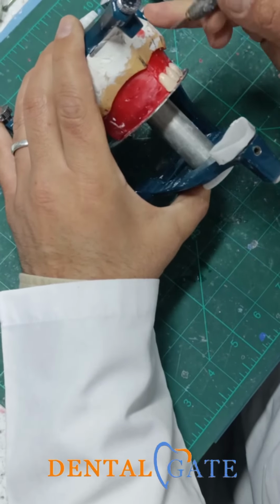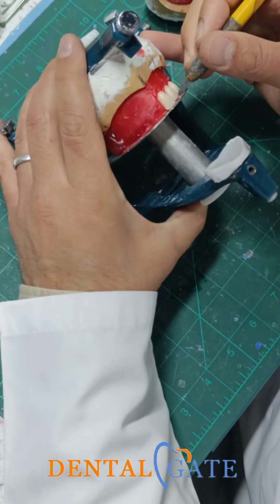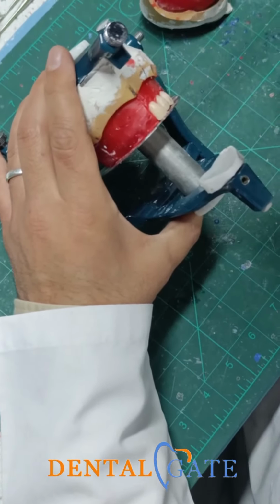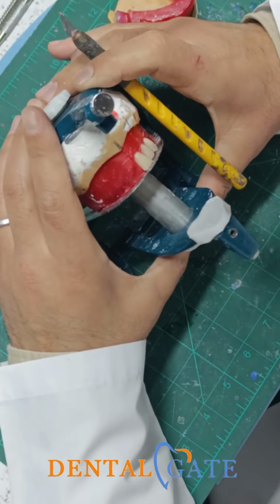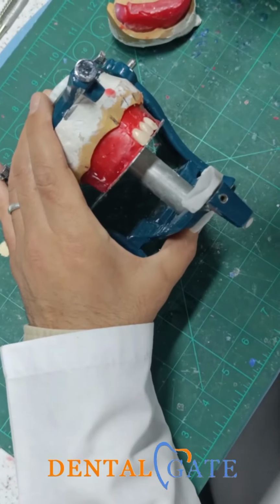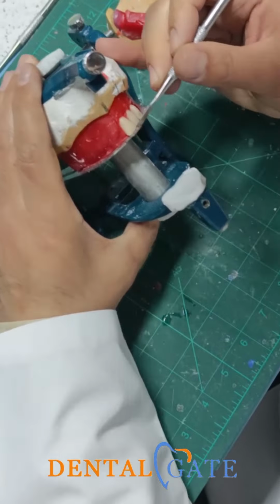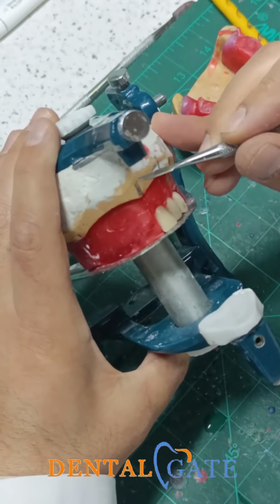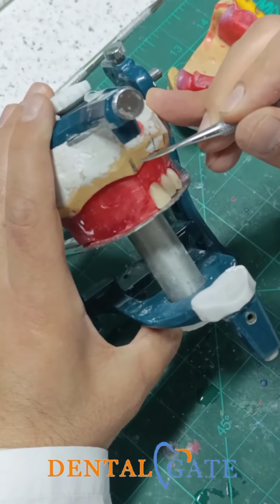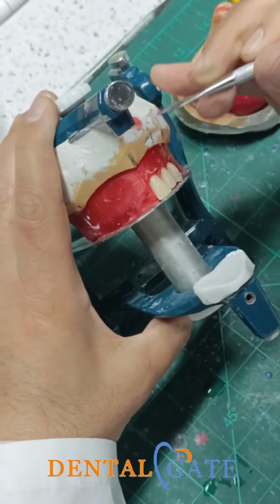So according to the principles and fundamentals, we arranged the three anterior teeth for one side. Make a revision because I will make the other side with the same principle. So you can see now the central incisor is fully contacted here within the table. The long axis of the central incisor is parallel to the vertical axis. So be sure the central incisor is upon the crest of the ridge.